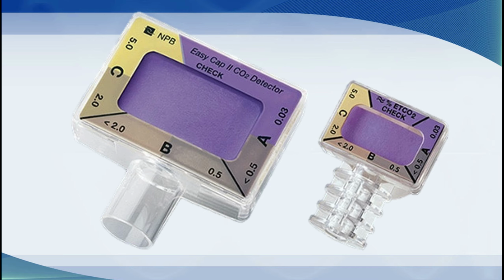The key element here is a piece of paper that is like litmus paper that interacts chemically with CO2 and changes color. You can see the percentage CO2 is related to the color change. This gold color is equivalent to 5% CO2. The bronze color is about 2%, and the purple color, the resting state, means pretty much no carbon dioxide.